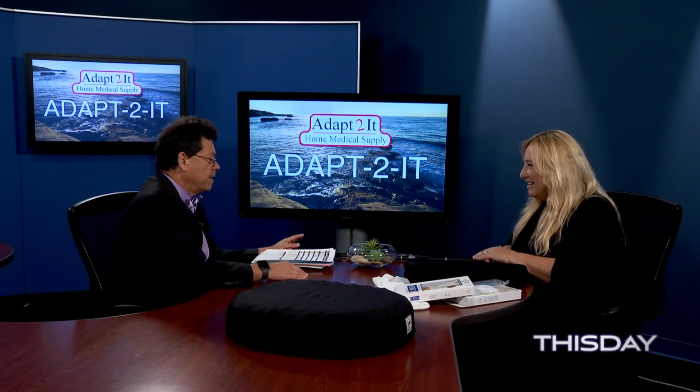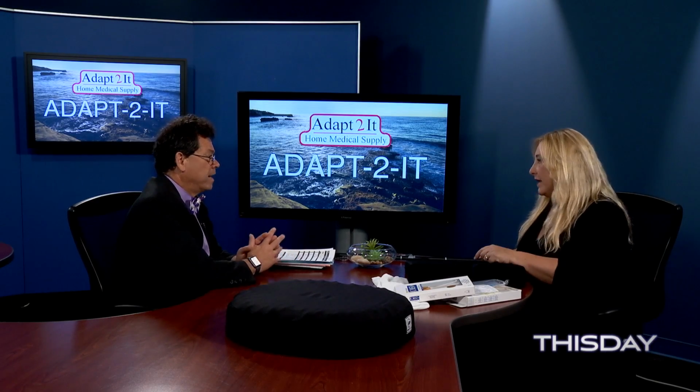Fancy, fun. And by the way, when it comes to the canes, would it depend on what ailment they have as far as the thickness of the cane or anything like that? A little bit, yes. Like if you were a larger person, you would want a sturdier, heavier cane. Right. If you needed more stability, we actually have bases that you can add to many of the canes, or we have those quad canes that already have the bases on them.